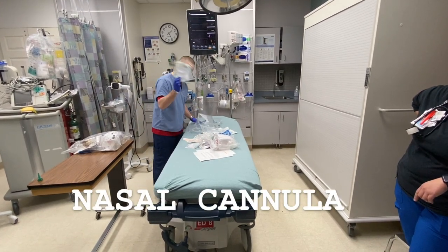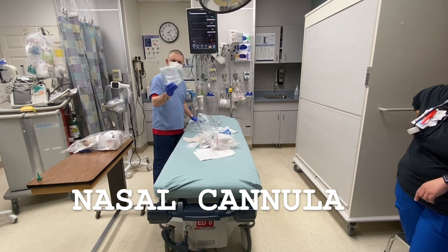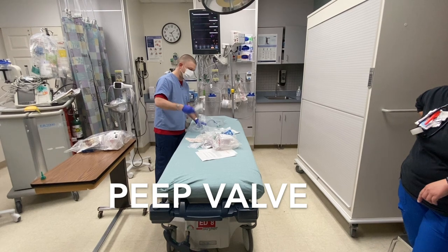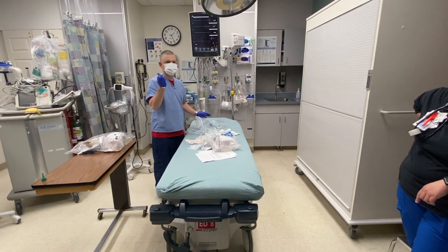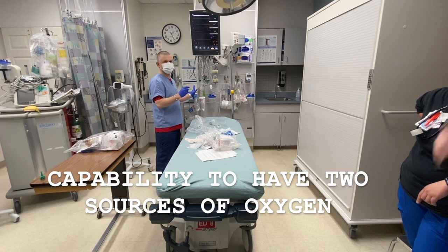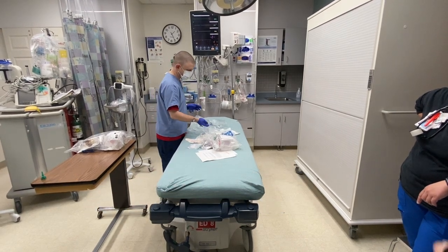And then just a regular, typical nasal cannula, a PEEP valve, and making sure that you have the two oxygen trees, because you have to run two separate oxygen flow meters.